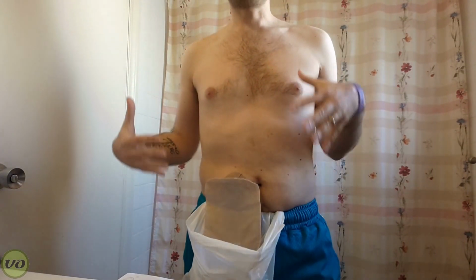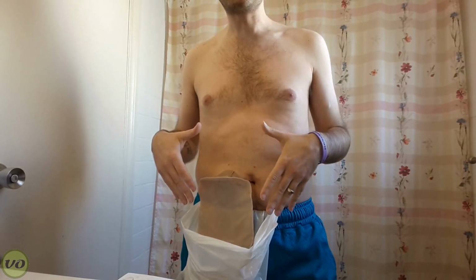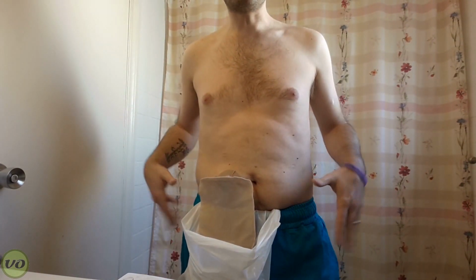Now what will happen is when I take off my appliance, it'll just fall into the bag and I don't have to worry about fumbling around with what to do with it. And it also keeps any output that's coming out of my stoma in the bag rather than going onto my pants, or some people I know will put a towel around them, and I think it just avoids a lot of problems.